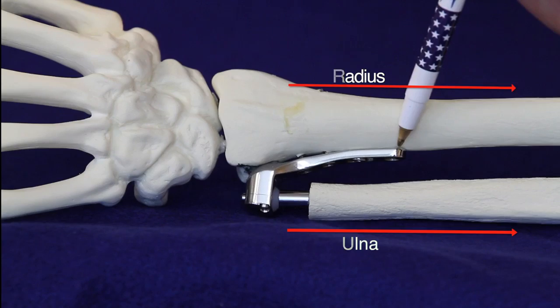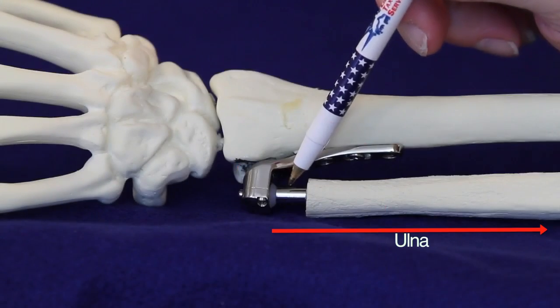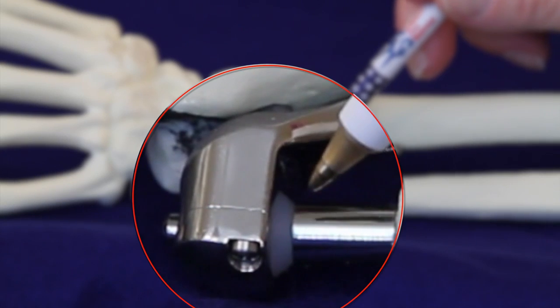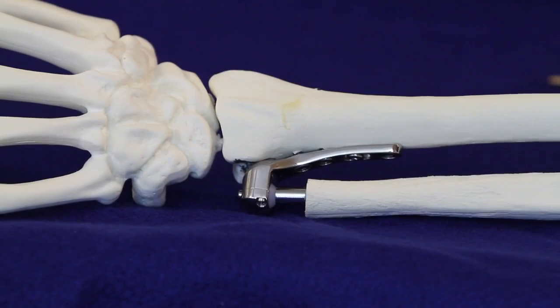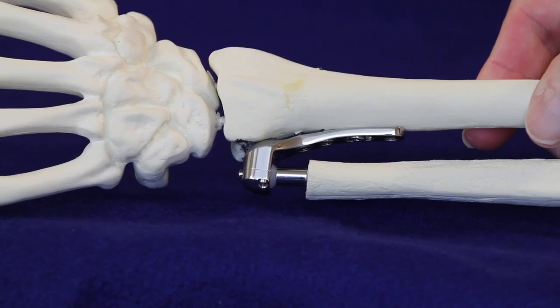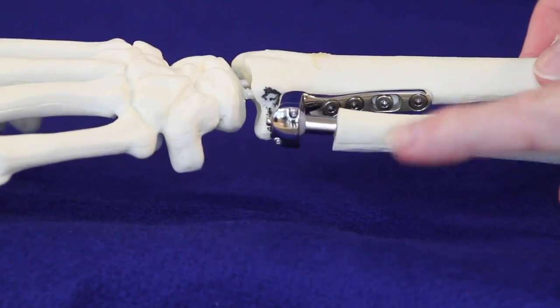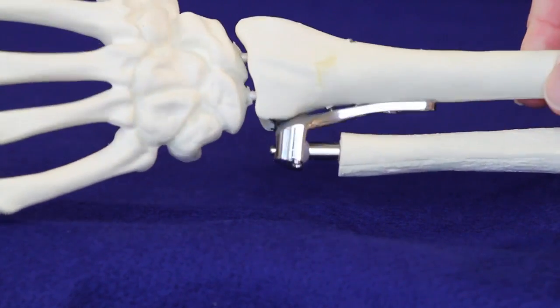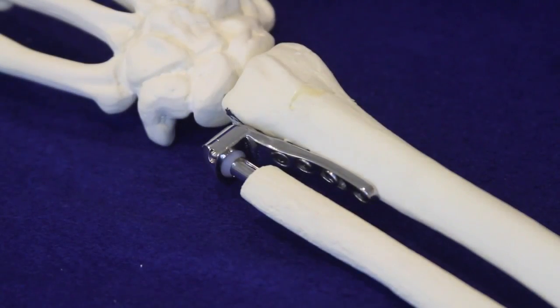Dr. Schecher's design consists of a plate attached to the radius with a metal ulnar stem going down the center of the ulna, and a polyethylene ball that allows articulation between the ulnar stem and the radial plate. This produces a constrained implant that eliminates the problem of convergence and instability. You can see that as this rotates, there's no instability of the ulna, the ulna can't migrate dorsally, and there's no convergence between the ulna and the radius.